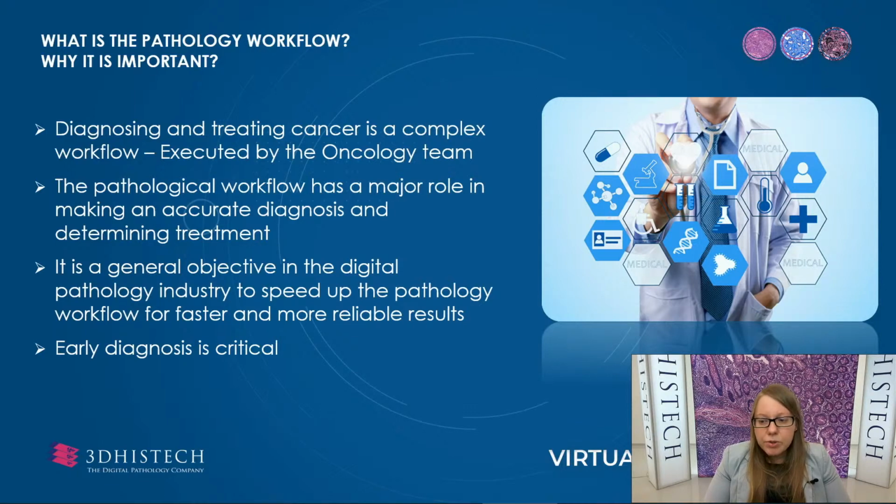The pathological workflow has a major role in making an accurate diagnosis and determining treatment. The pathologist determines the exact type of the tumor. If we know the type of the tumor, the right diagnosis can be determined, meaning the therapy could start sooner and thus increase the chances of healing. It is a general objective in the digital pathology industry to speed up the pathology workflow for faster and more reliable results.